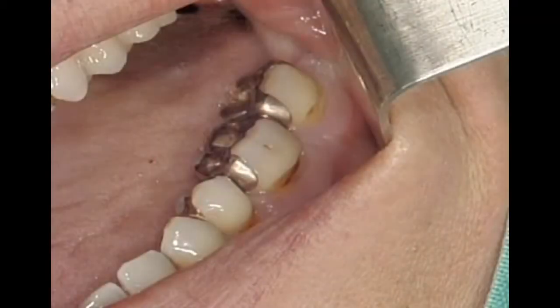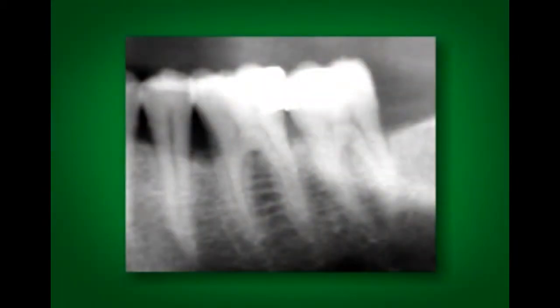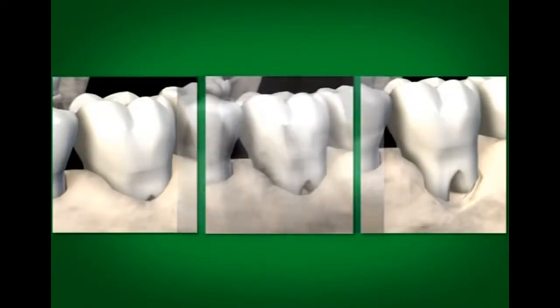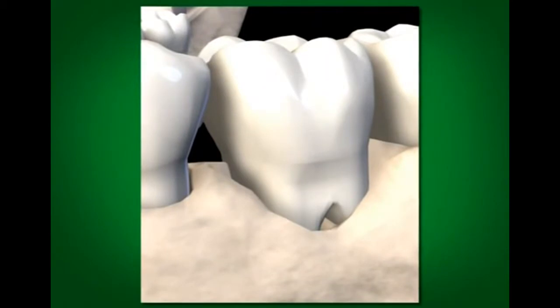After the complete elimination of periodontal disease, the dentition of this 55-year-old female patient appears healthy. Nevertheless, around teeth 3.6 and 3.7, probing has revealed bone loss. The radiograph indicates that bone loss and furcation defects will be revealed after the gingival flap has been elevated. Emdogain treatment is indicated for degree 1 and 2 furcation defects.